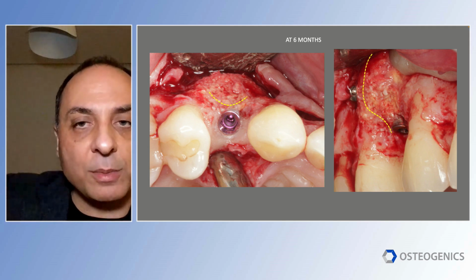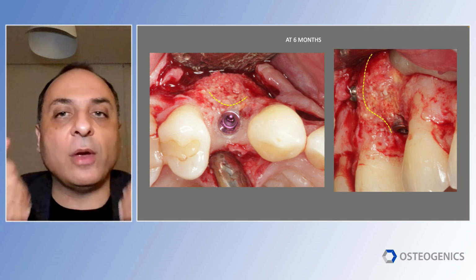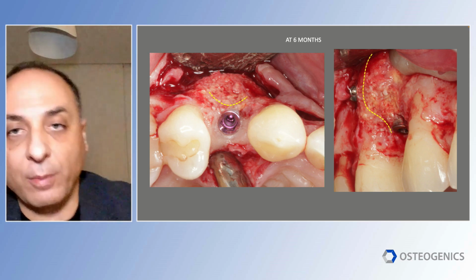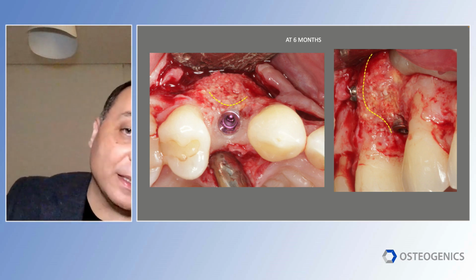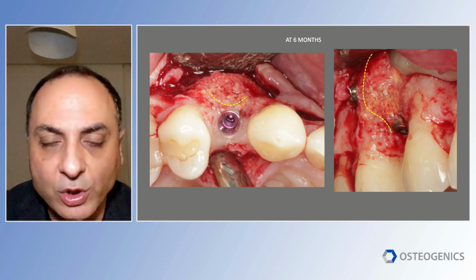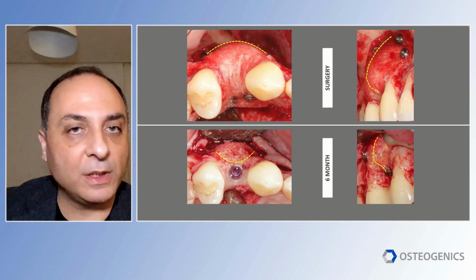We had the translation because of the tension of the flap, because we have so much tension when you have a single tooth. So there is a flattening effect of the overlying flap on the ridge. So if I have an aesthetic area, a single tooth, I don't do a sausage. I do something else. So you see the problem?